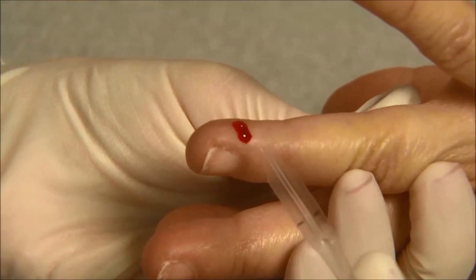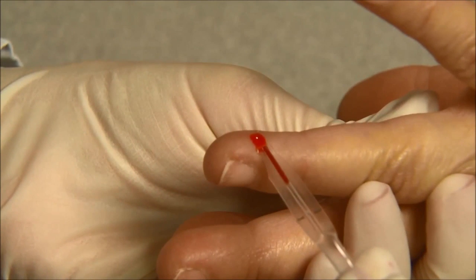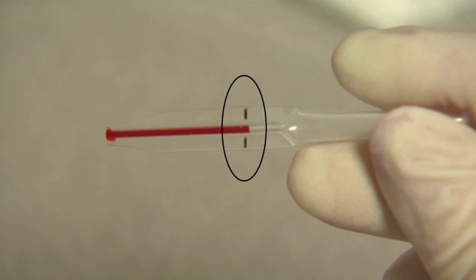Collect capillary blood of 10 microliters for the individual test device using a capillary transfer tube or a pipette. The capillary transfer tube will fill automatically. It is important to use the capillary transfer tube to collect specimen in order to receive accurate results. Make sure the blood covers the air vent of the tube or it will be difficult to squeeze the blood out. Never squeeze the capillary transfer tube while sampling.